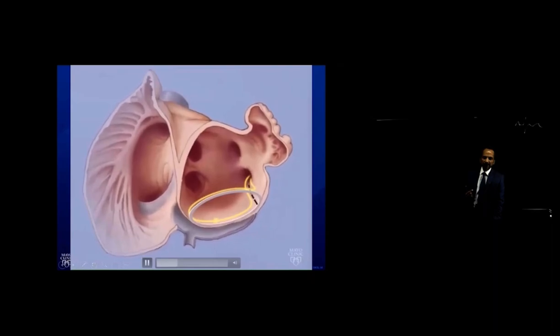But that circuit, instead of only hugging around the mitral valve, may be going in and out of the pulmonary vein and then completing the circuit. Now, even if we isolate the pulmonary vein, it's still possible, through gaps in our isolation sequence, or even through slow areas of conduction in the posterior wall, in the roof, between a roof line, we can complete a complex circuit of flutter, even though we can entrain near the mitral valve in one location.